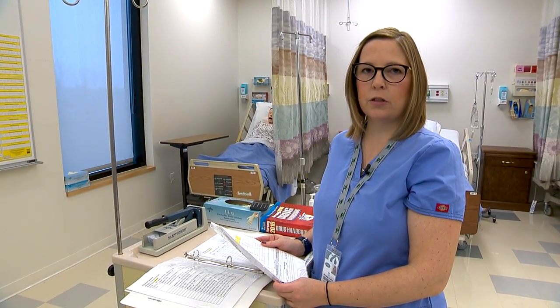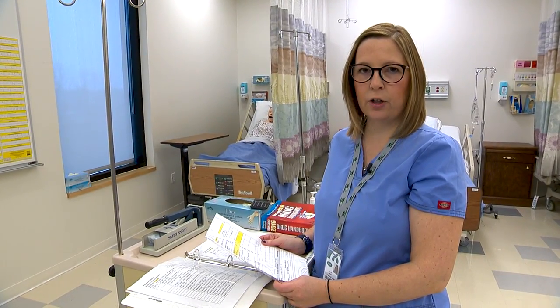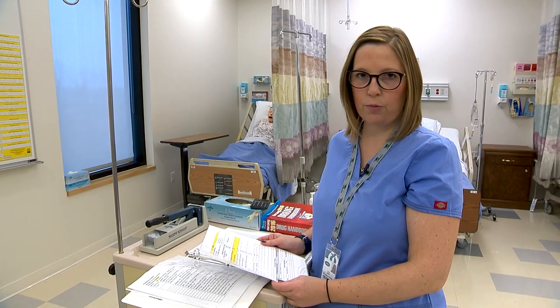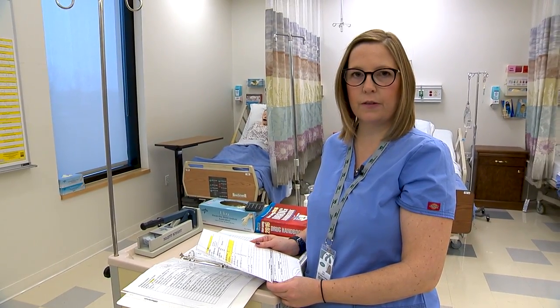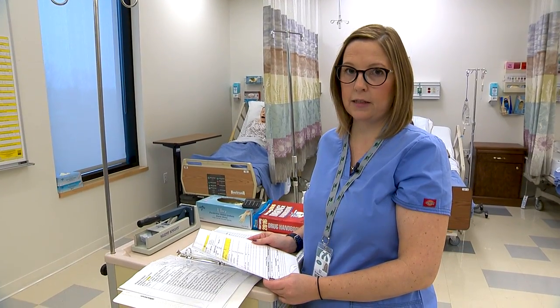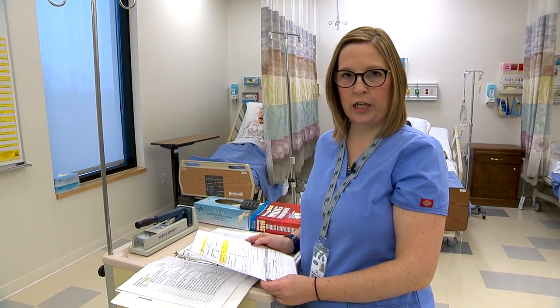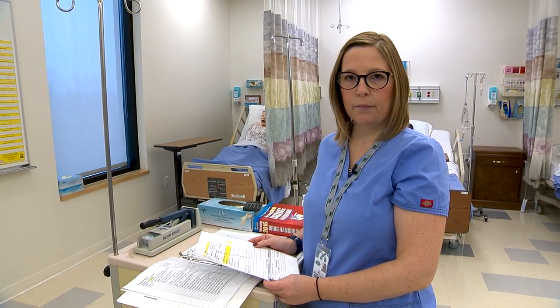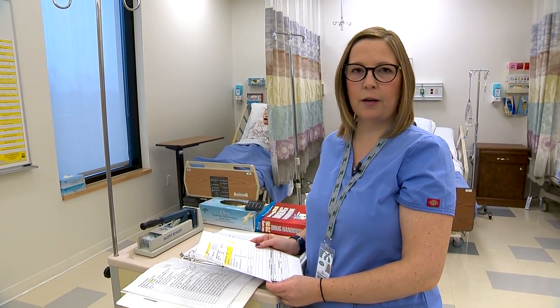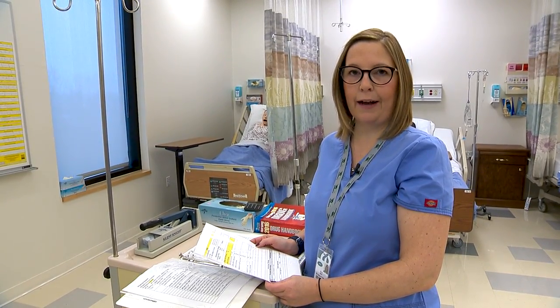I also will document that he tolerated the procedure well. There was no swelling or burning at the IV site. I will then return to the patient's room in 15 to 30 minutes to make sure that the medication is still infusing and that the patient has no complaints. I will assess the patient for adverse effects such as itching, burning, anaphylactic shock or shortness of breath, and to make sure that my IV site is still intact. This completes our skill of IV piggyback.